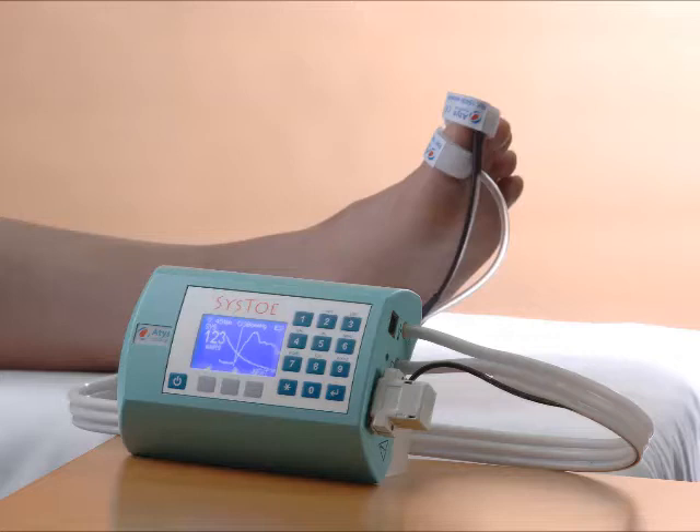For this video, for this training, I will measure the systolic pressure on my thumb instead of on the great toe.